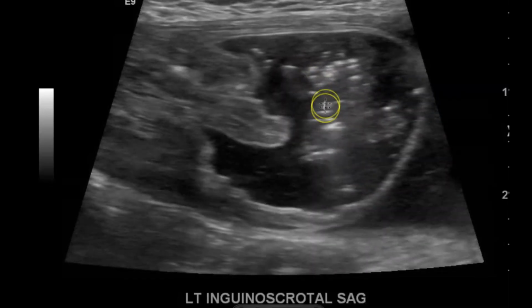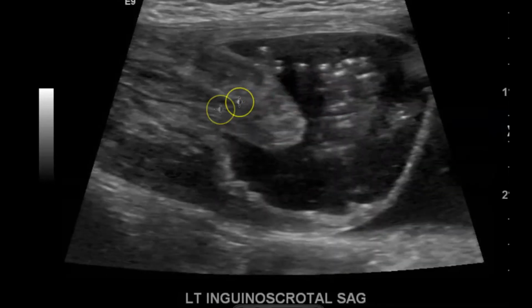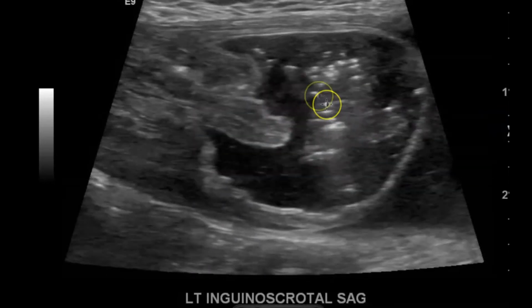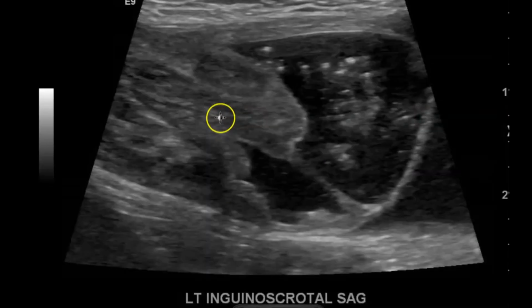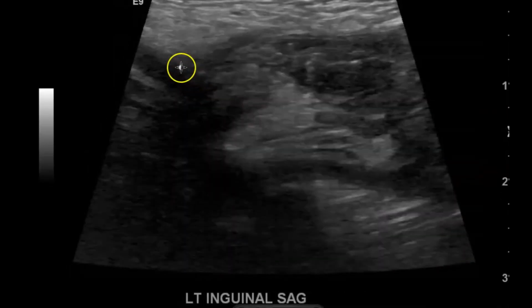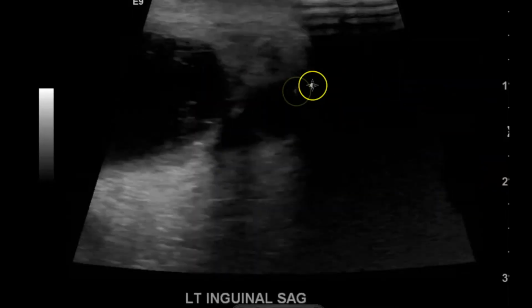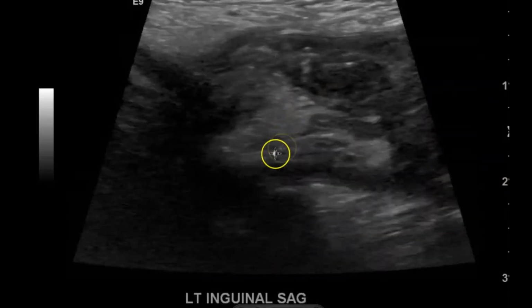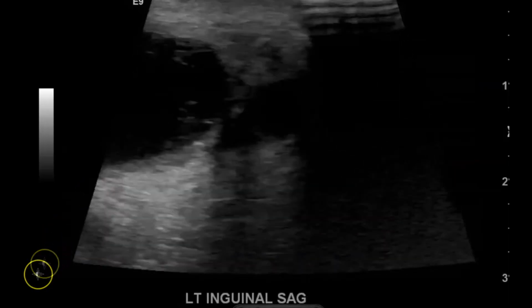And this is why clips are important, because you can show that there's peristalsis, or you can show that it's fat, or fat and bowel, and you can show that it's reducible or not reducible, or that you can create the hernia with Valsalva. And here's a clip from the beginning of the hernia trekking down into the scrotum. So a bowel against that complex fluid around the bowel. Very interesting case. All right, on to the next one.